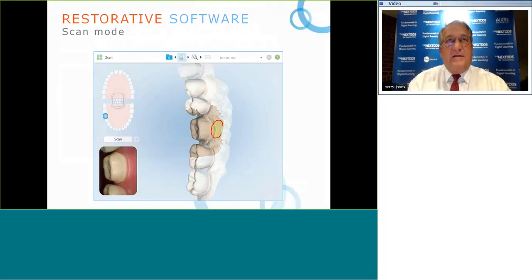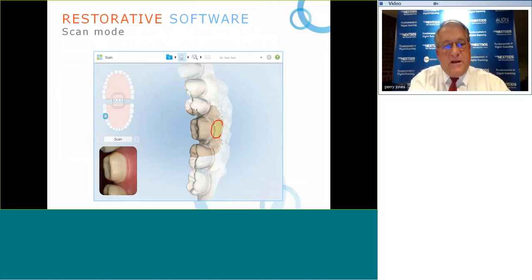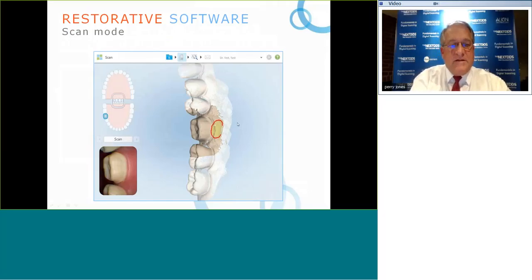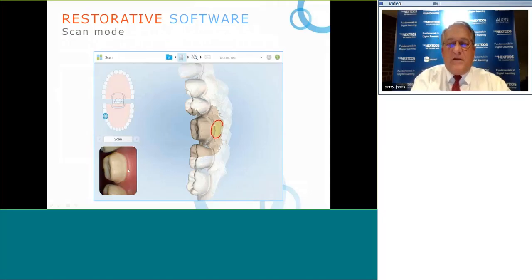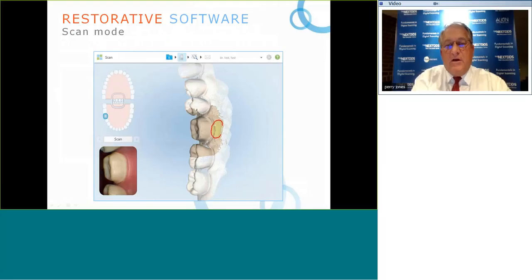Because digital scans are very accurate sources of data, there are tools embedded in the software to manipulate virtual representations on the computer screen. Looking at this screenshot from the iTero Element scanner, in real time the left-hand corner shows exactly what you see through the scanner in the mouth, which then becomes a virtual graphic representation on the computer screen. You can also see the outline of the area viewed in real time.